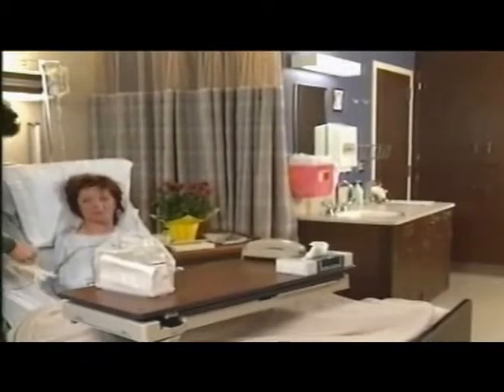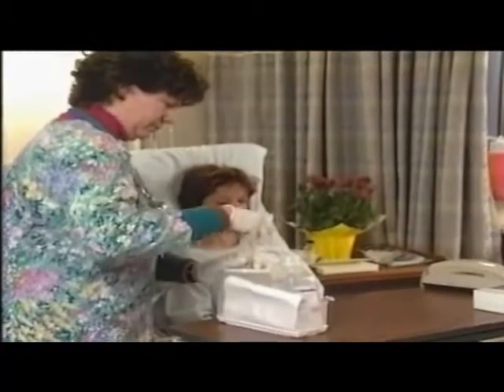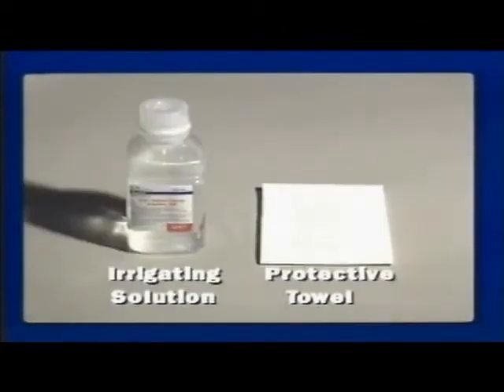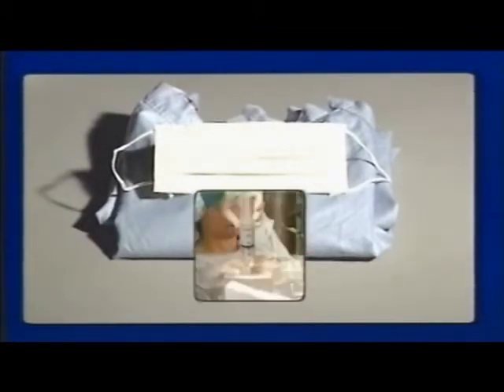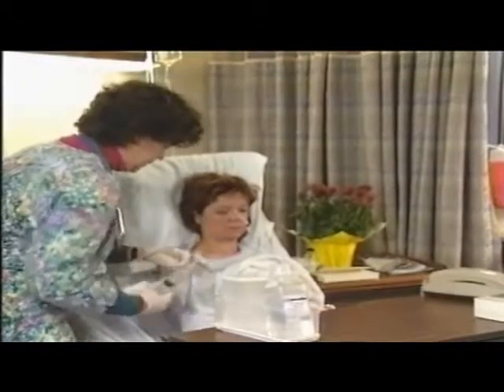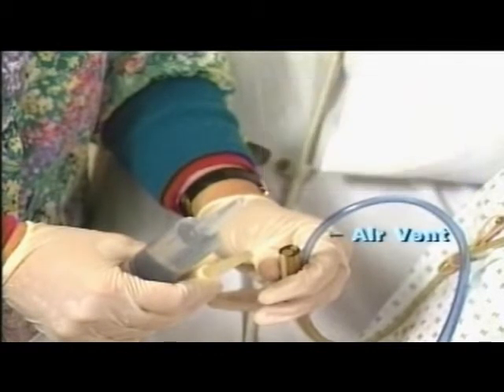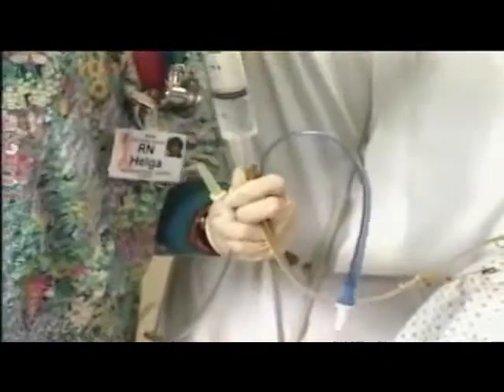Irrigation may be required when the tube is blocked or occluded, or following the giving of a medication. After checking the doctor's order and agency policy, prepare equipment at the bedside: clean gloves, a catheter-tipped syringe, appropriate irrigating solution, and protective towel. A mask and gown may be needed in some cases. Draw up 30 milliliters of the irrigant into the syringe. Disconnect the tubing from suction, verify placement, and connect the syringe. Note that the small lumen or blue section of this tube is an air vent and should not be used as an irrigation port.